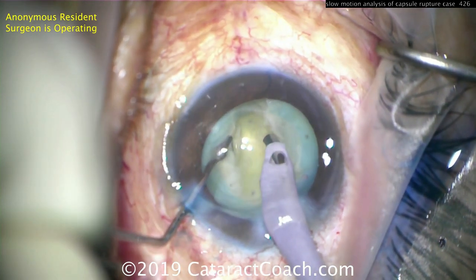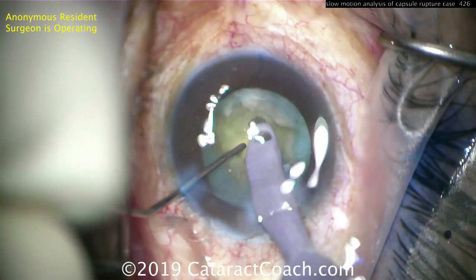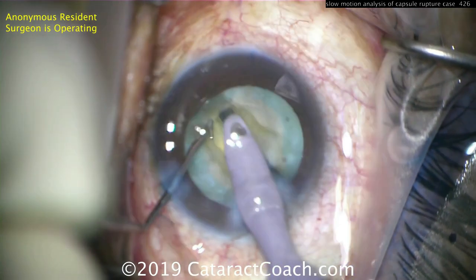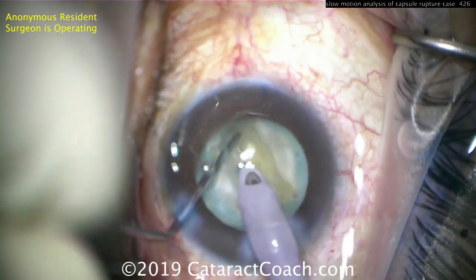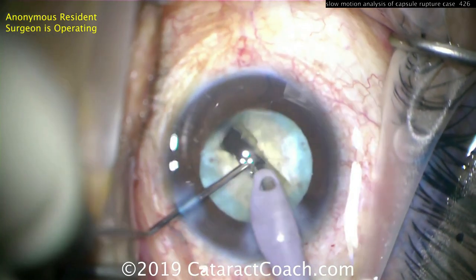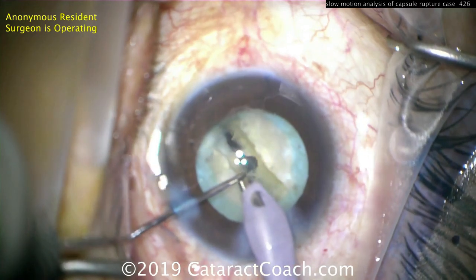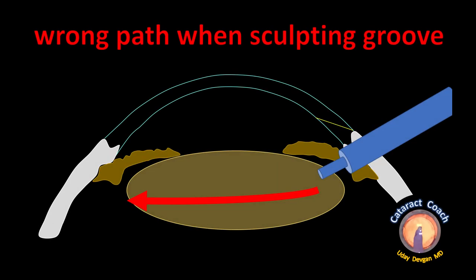When it's time to split the nucleus, the resident will cause that puncture to become a huge tear. There's a partial split of the nucleus, but watch carefully — right about now you'll see a snap. Pow — it snaps. That quick snap was the entire posterior capsule rupturing right down the middle.